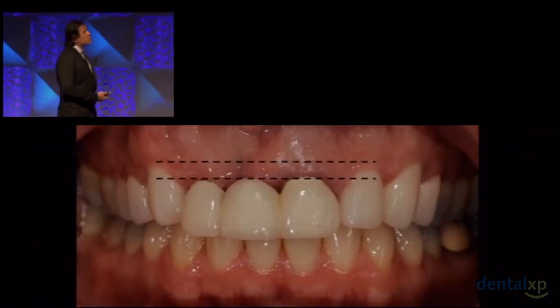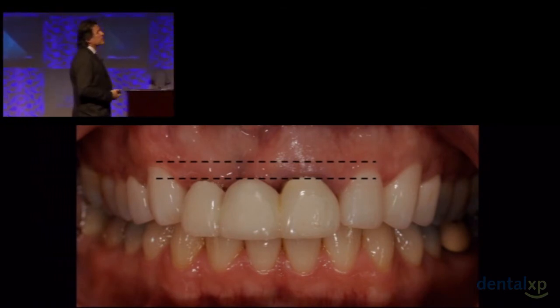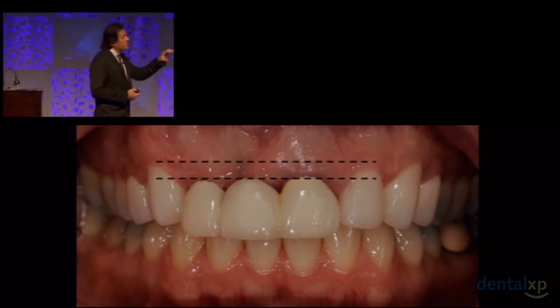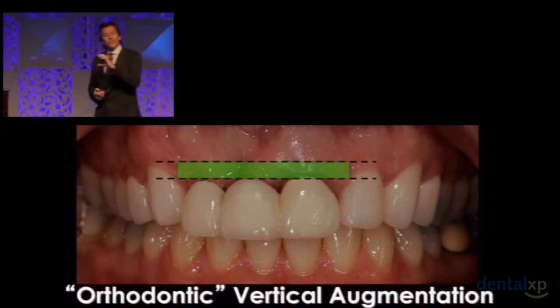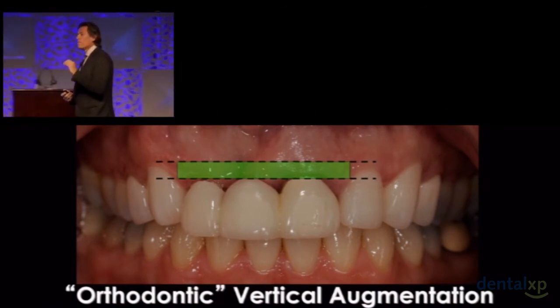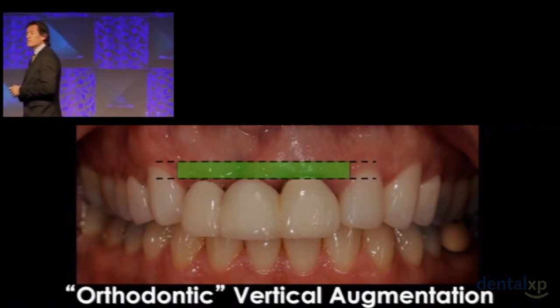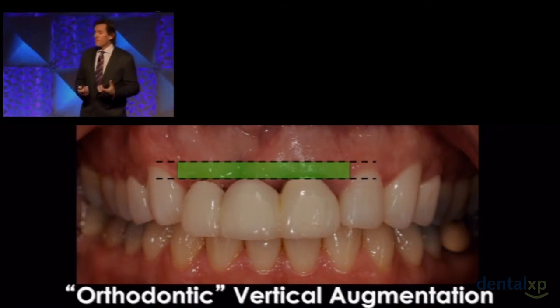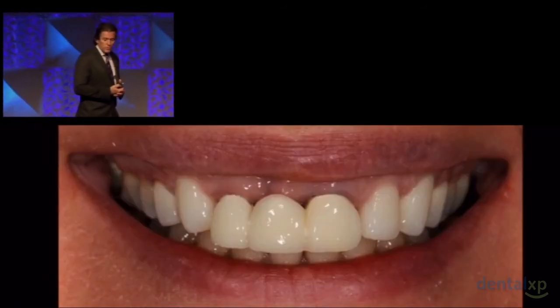And by the time I erupt the teeth, after 3 months, and I stabilize them, patient comes in, I take the brackets off. You can see that as I extruded the teeth, the bone and the gingiva came down with it. And that extra gum is going to work to my benefit and for the patient as well. And the bone underneath is going to allow us now to treat the case as a type 2 labial defect, which is much more predictable in terms of bone regeneration.